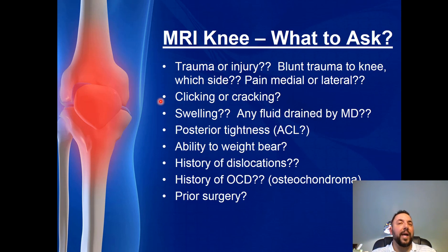What are you going to ask your patient for your radiologist, so that they can make the most accurate read possible? Was there trauma or injury? Blunt trauma to the knee? Which side? Is there pain medial or lateral? Is there clicking or cracking? You want to know if there's any swelling, and was any fluid drained by the doctor? Was it fluid? Was it blood?